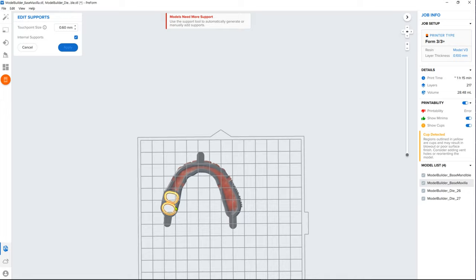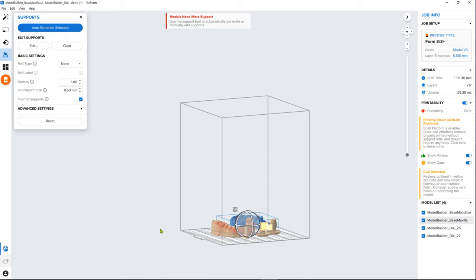When printing a hollow 3D model, it is recommended to add internal support in hollow parts to avoid unsupported elements floating in the tank.